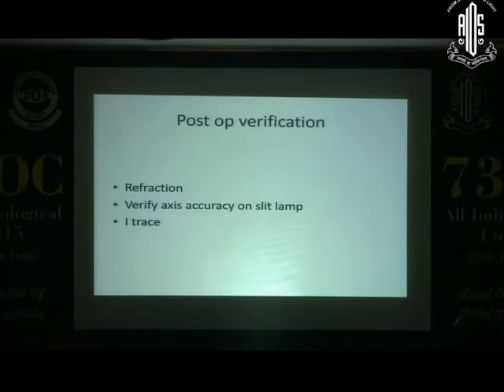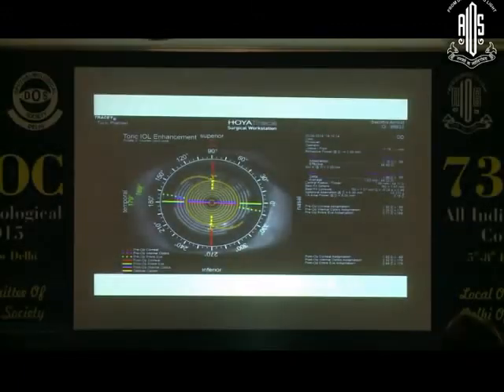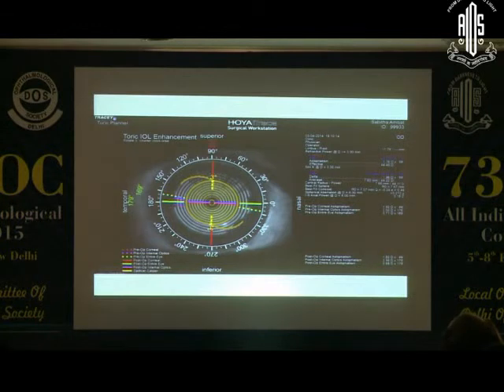If the axis coincides, absolutely fine. If it is off by a couple of degrees or 3 degrees, leave it alone. If it's grossly off-center, then you can take the patient back immediately to the theatre and reposition the lens. Probably that rotation occurred because the bag was hyperinflated immediately after surgery. Eye trace is brilliantly useful in this. You can take the patient back immediate post-op, put them on the eye trace and it will tell you how many degrees you're off.